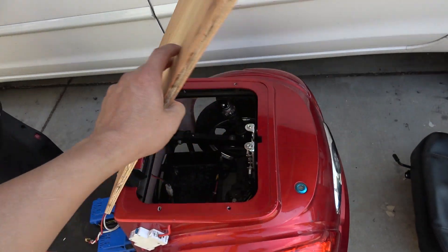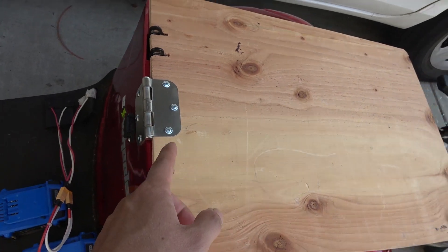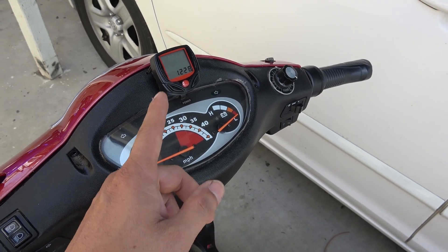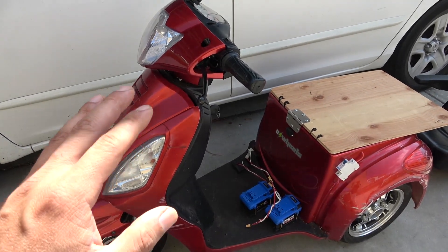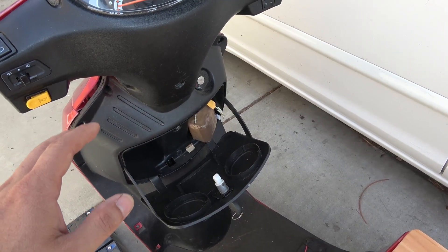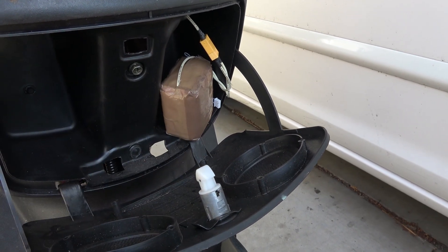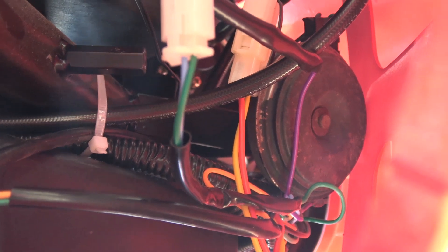I put in a plywood seat that I can easily open up to access the battery compartment inside. I installed a door hinge so I can open and close the plywood panel. The original speedometer is not accurate at all, so I installed my own. All the original incandescent light bulbs burned out — not surprisingly since they run on 48 volts — so I'm replacing the whole electrical system with a 12 volt system. Here's my 12 volt lithium-ion battery made from six Tesla Model 3 2170 cells — it's a 3s2p configuration.